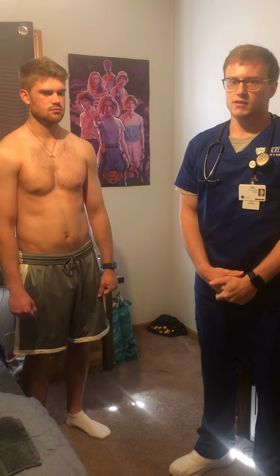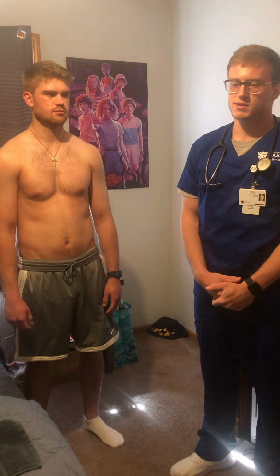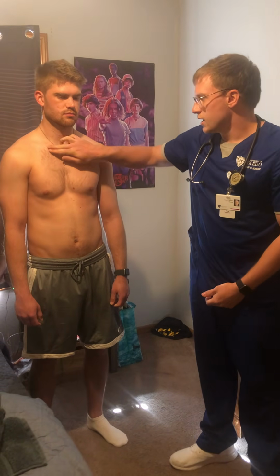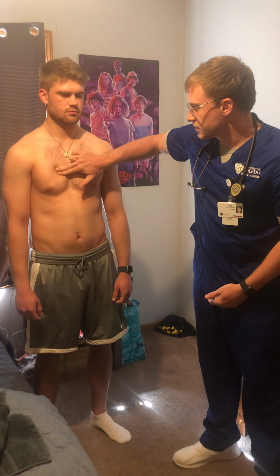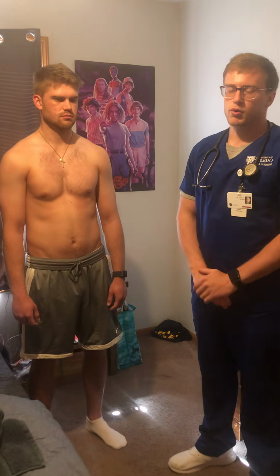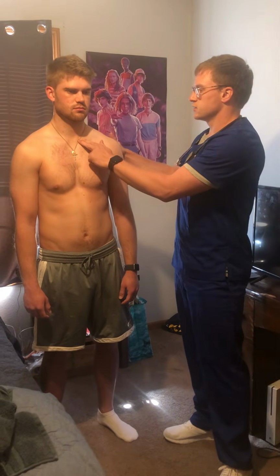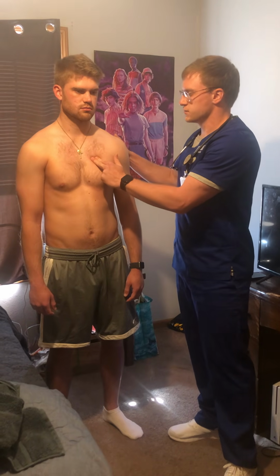We're going to be assessing 5 heart sounds and their locations. The first one is the aortic heart sound, which is on the right sternal border, and I'm going to go ahead and locate it now, and it is in the second intercostal space. The next one is the pulmonic heart sound, which is the same, just on the other side. So it is on the left sternal border at the second intercostal space.